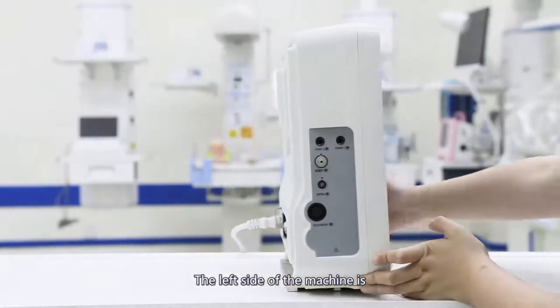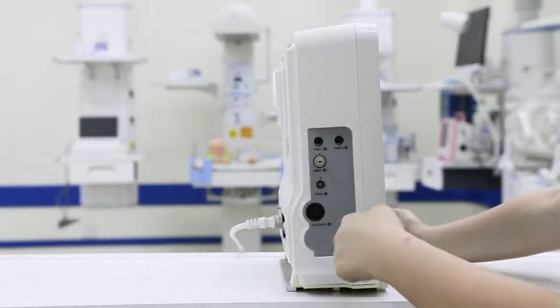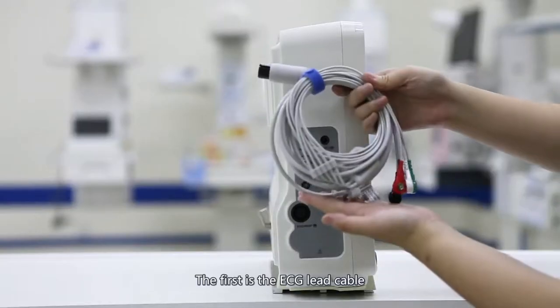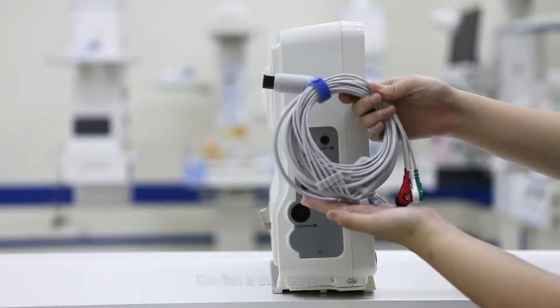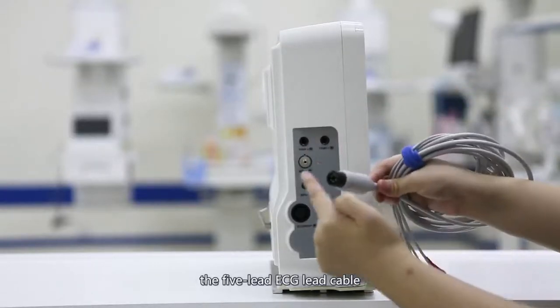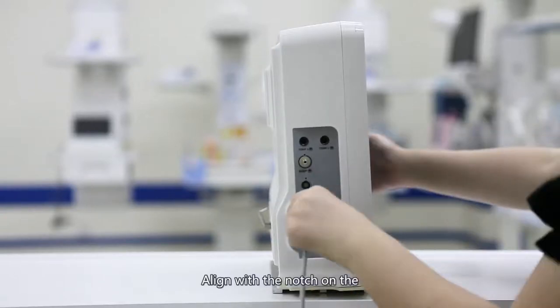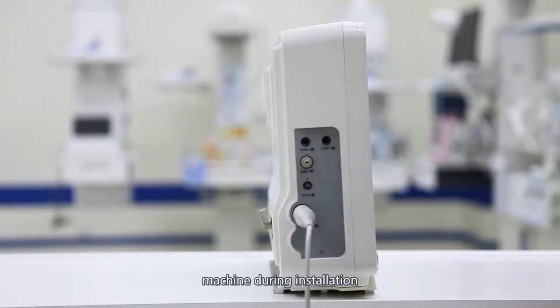The left side of the machine is the connector interface. This is our standard accessory. The first is the ECG lead cable. Our standard configuration is the 5-lead ECG cable. There is a slot here; align it with the notch on the machine during installation.